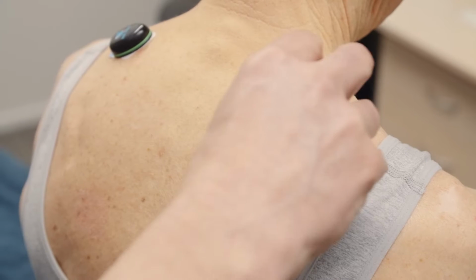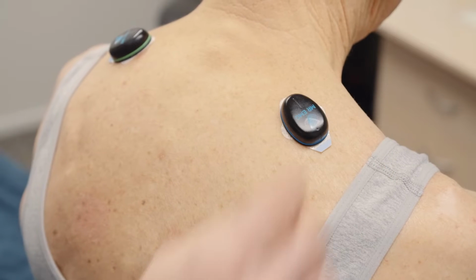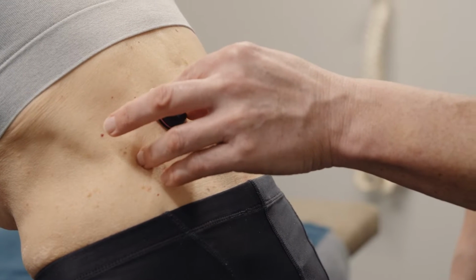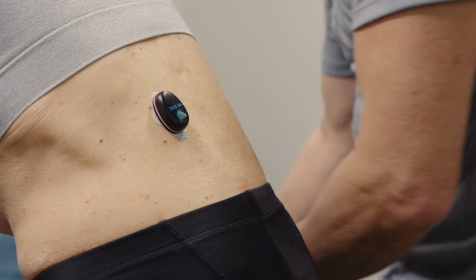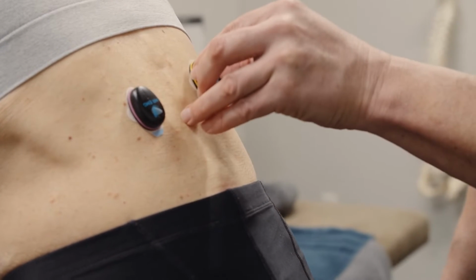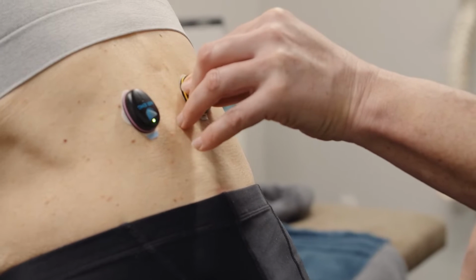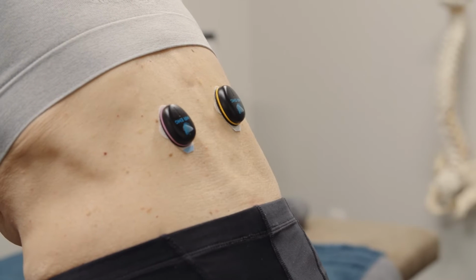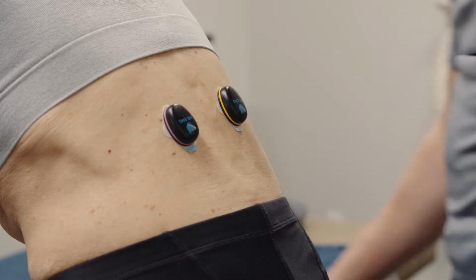Begin by placing MR EMG sensors on your subject's upper trapezius muscles and lumbar paraspinal muscles. When applying sensors to the lumbar paraspinals, have your subject stand and flex forward slightly, as demonstrated here. Doing this will reduce signal artifacts caused by skin movement during testing. Follow our recommended muscle placement sites.